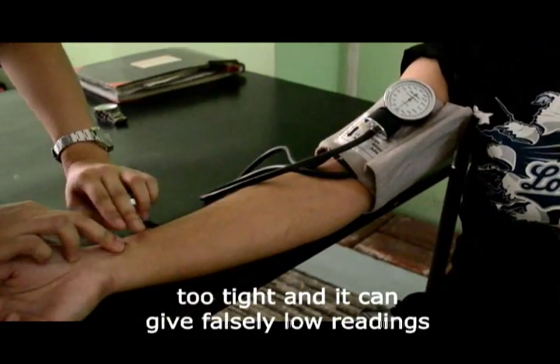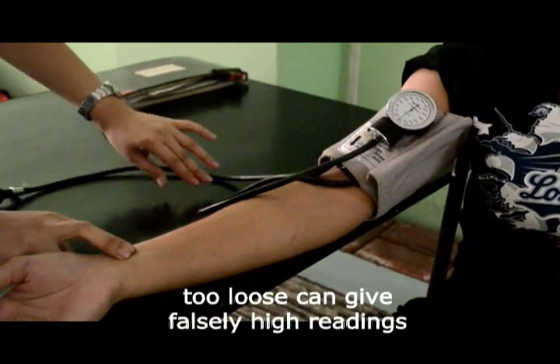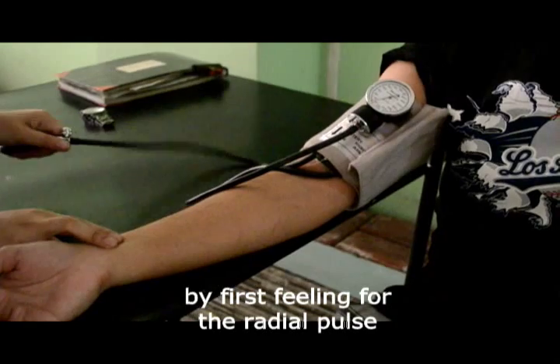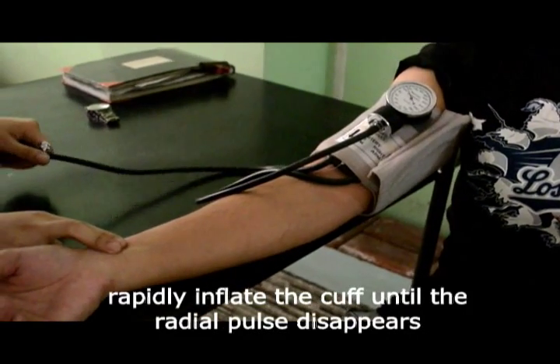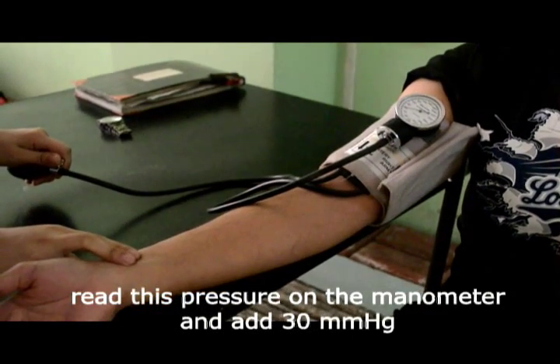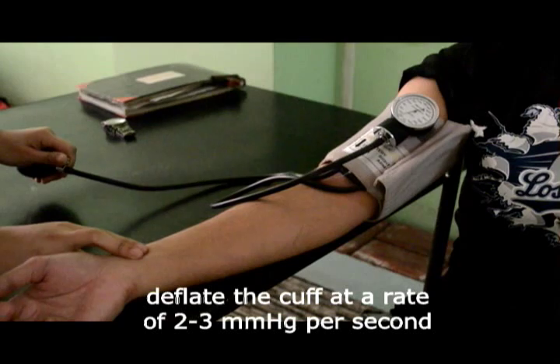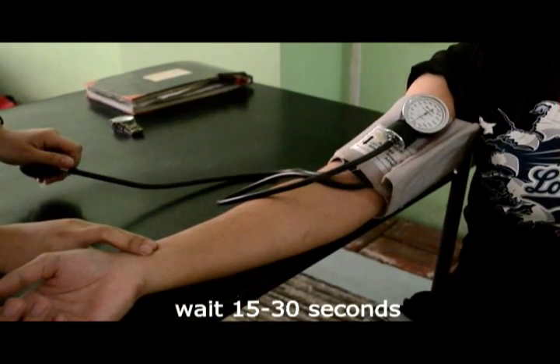Too tight, and it can give falsely low readings. Too loose, and it can give falsely high readings. Estimate the systolic pressure through palpation by first feeling for the radial pulse with the tips of the first two fingers of one hand. Rapidly inflate the cuff until the radial pulse disappears. Read this pressure on the manometer and add 30 mm mercury. Deflate the cuff at a rate of 2–3 mm mercury per second. Wait 15 to 30 seconds.